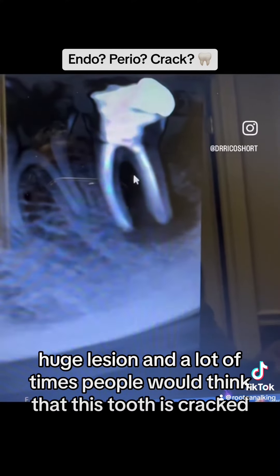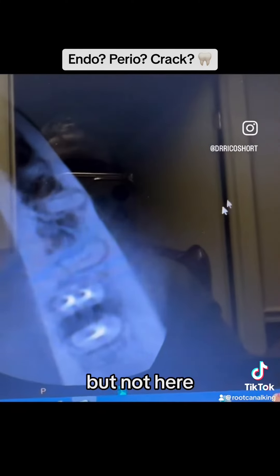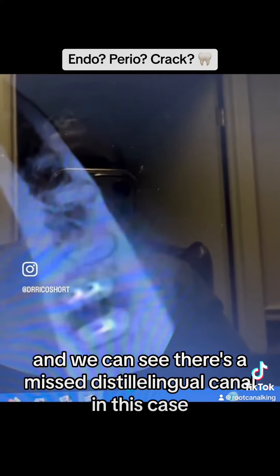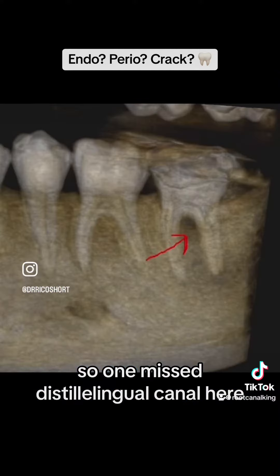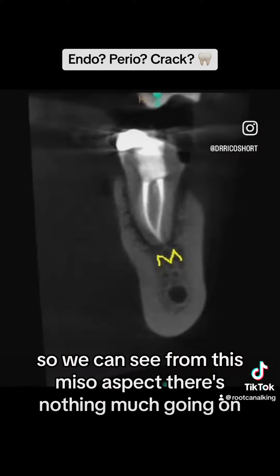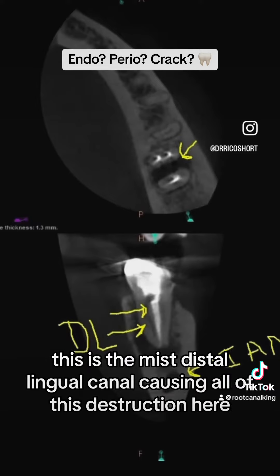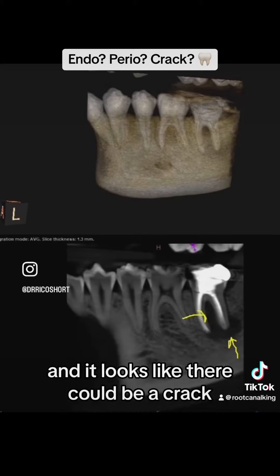A lot of times people would think that this tooth is cracked and needs extraction and an implant, but not here. We can see the mesial buccal and mesial lingual canals. There's a missed distal lingual canal in this case, and one missed distal lingual canal could cause all of this bone destruction. From the mesial aspect there's not much going on, but look at the distal aspect — this missed distal lingual canal is causing all of this destruction. It looks like there could be a crack, but that's not the diagnosis.